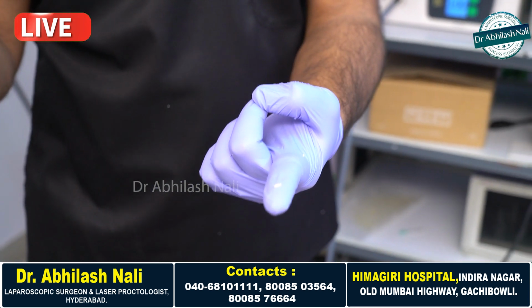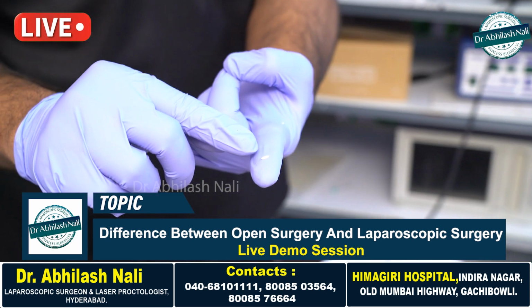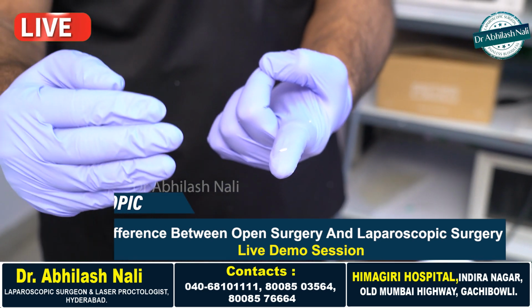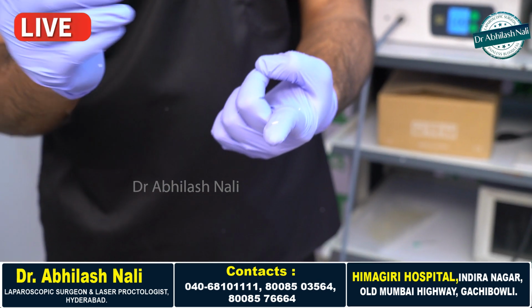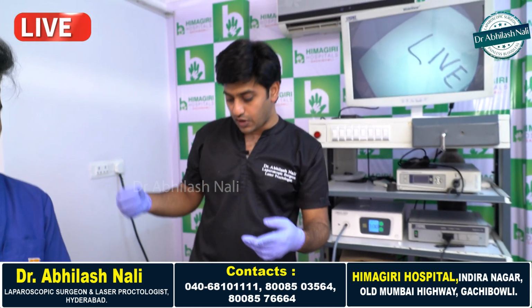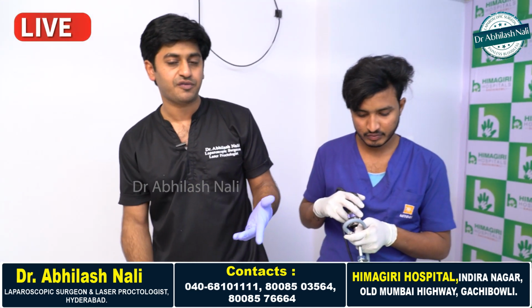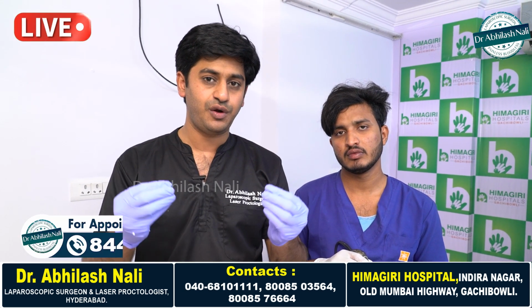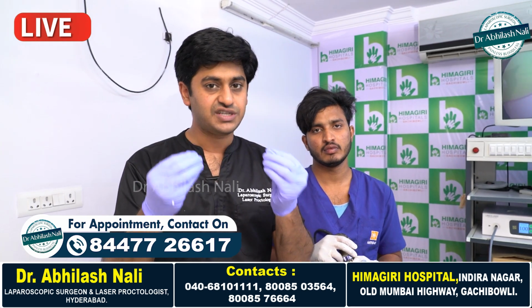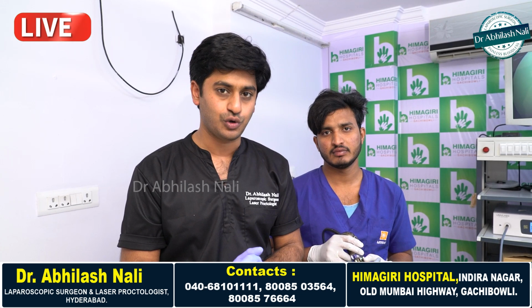Through this laparoscopic camera system, even the smallest rice grain will appear 15-fold or 20-fold increased in size. Because of this advanced technology, the emergence of complications in laparoscopic surgery is far lower compared to open surgery, because we have a detailed vision of the abdominal organs.